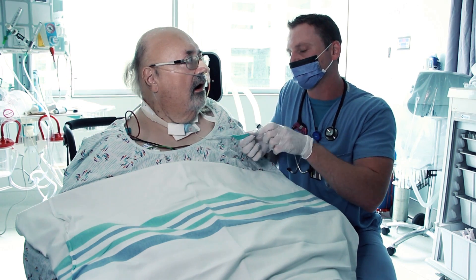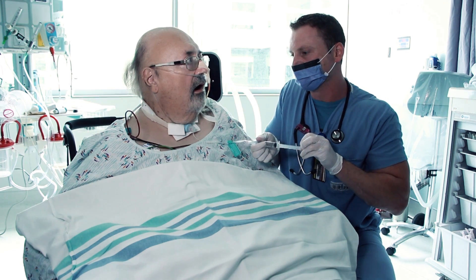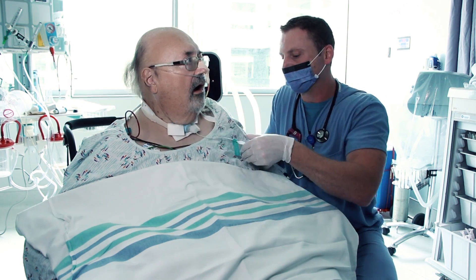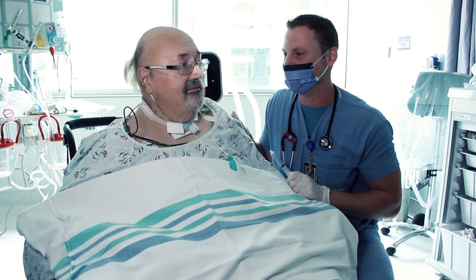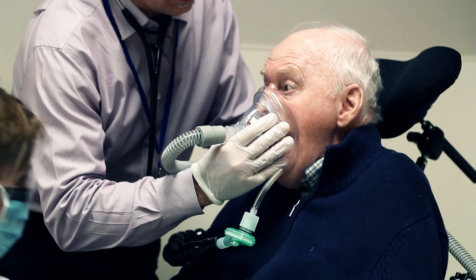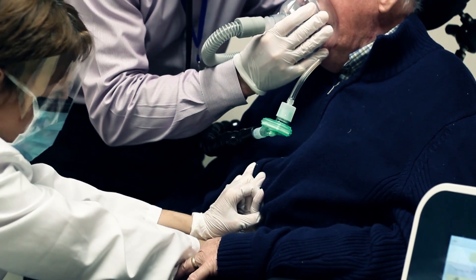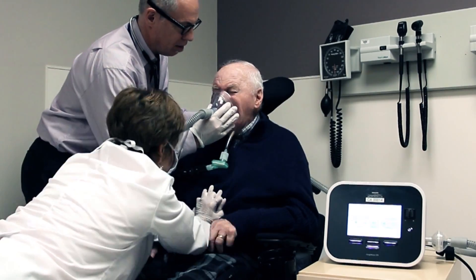Alright Chester, I'm going to deflate your cuff and put your cork back on your trachea — I want to hear your voice now, okay? So your cuff's deflated and I'm going to put the corking valve on. Can I get you to say hi? Hi. Perfect. You're still here? Excellent. In the absence of contraindications, mechanical insufflation exsufflation cough capacity may be further improved when manually assisted cough is timed with the exsufflation phase.